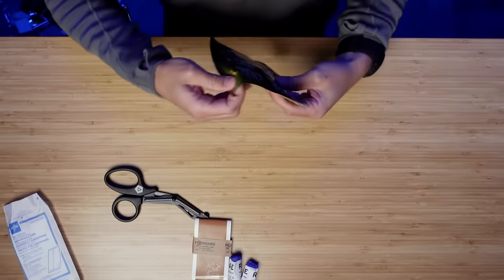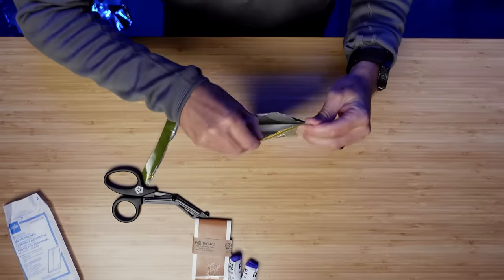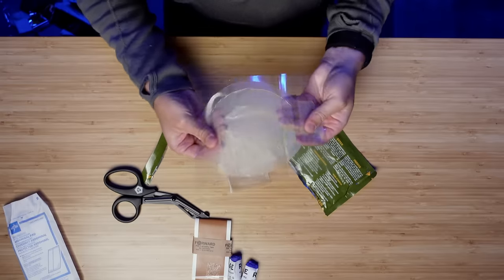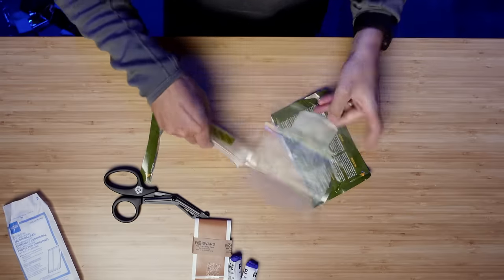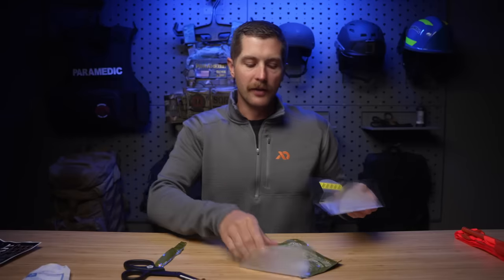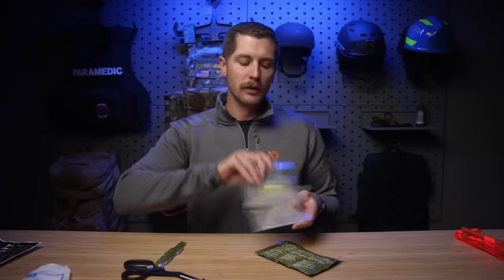Next up, we've got the Halo twin-pack chest seal. I usually go with North American Rescue — nothing wrong with Halo, they just have a little bit of a different seal on them. We've got one that's unvented and one that is vented, marked right in the middle. The vented one would go in the front for something like a gunshot wound, and the unvented one would go in the exit wound. They both just stick to the chest. People mention you can use them for abdominal eviscerations — yes, you can, though that's not their primary use. They're called a chest seal so you'd assume they'd be used on the chest.